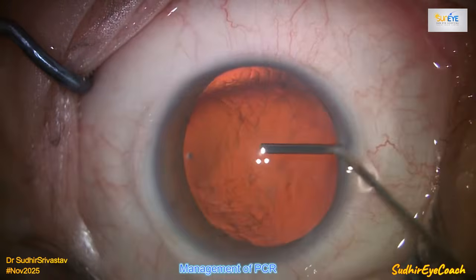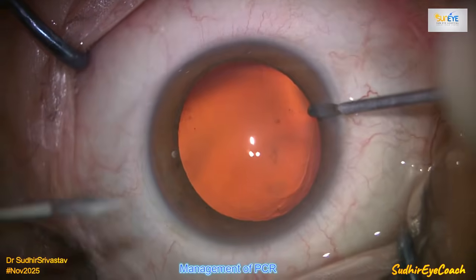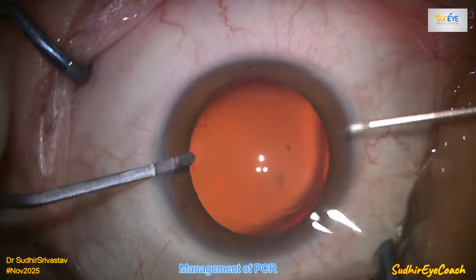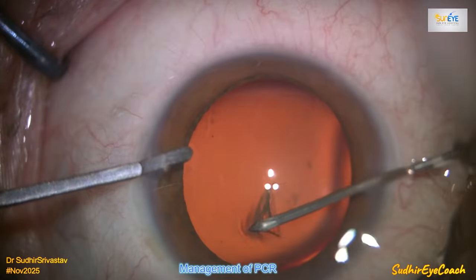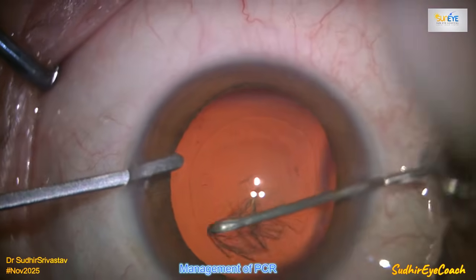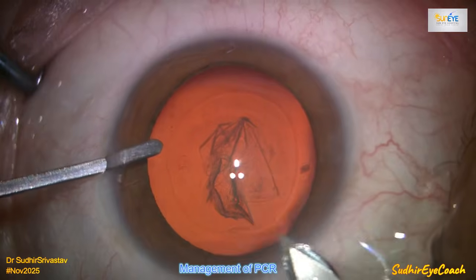Today I'll be sharing a video of a routine case during which a posterior capsular rent occurred. These things can happen unexpectedly and at times we may not even know the exact reason. It was a normal looking case with a pristine clear cornea. The patient had a grade 2 nuclear cataract, and performing phacoemulsification in such cases is generally not very challenging and often quite rewarding for the surgeon.